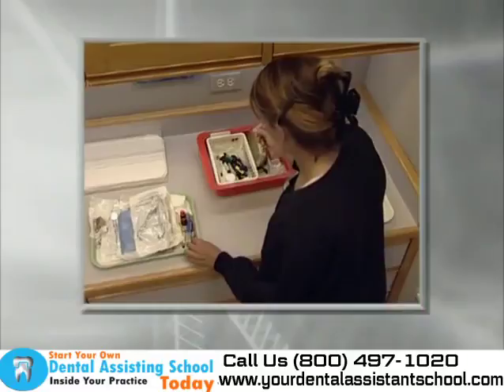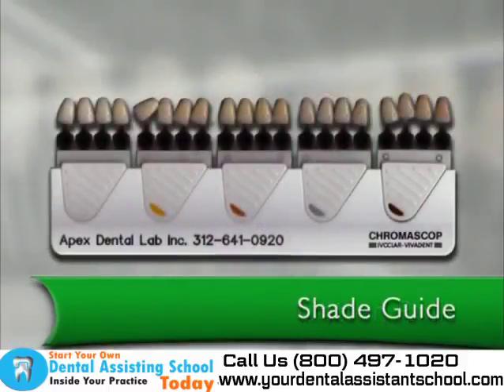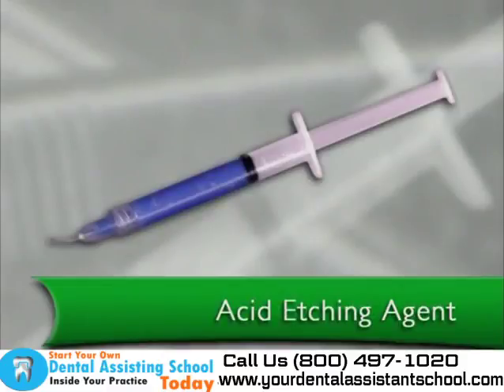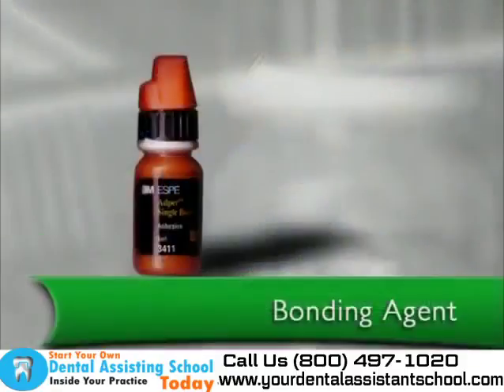Additional materials and instruments on a composite restoration tray include cotton rolls for soaking up excess moisture during a dental procedure and for isolating a tooth or an area of the oral cavity. Shade guides for establishing the color of the restoration so it matches the shade of the tooth. A spoon excavator for excavating soft caries. An acid etching agent for preparing the enamel surface. It causes irregularities in the tooth surface, allowing the bonding agent to function better. A bonding agent attaches to the irregularities of a tooth, allowing composite resin to better adhere.